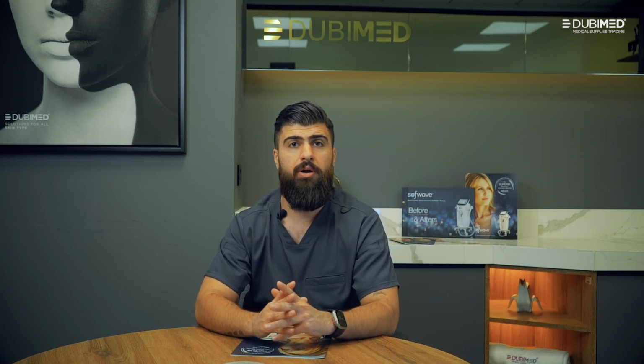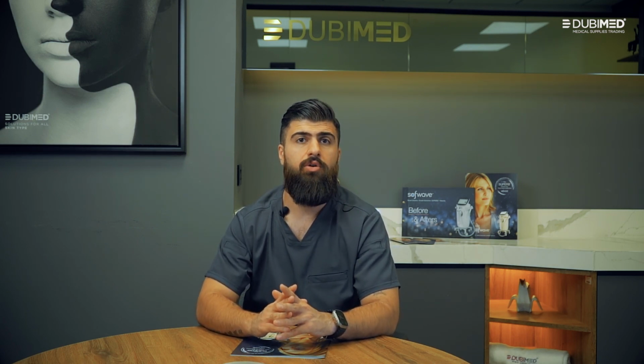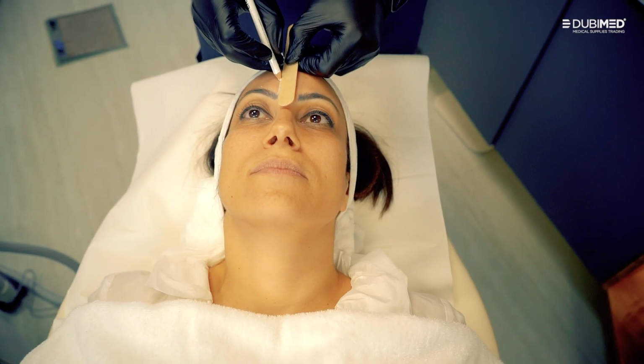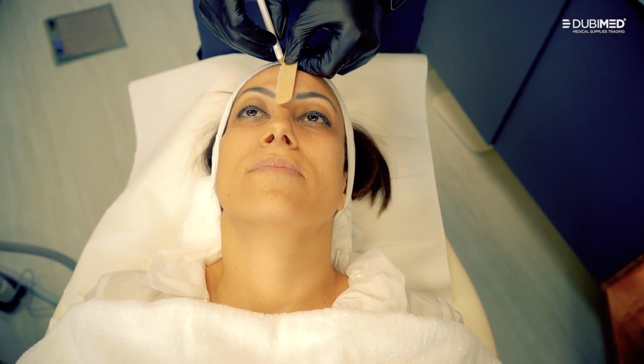Now in this video, I'm going to show you how to turn on the machine, how to set it up, to dial in your parameters, draw the no-fly zones on the face of the patient, and also how to do the treatment step by step. So I will show you the no-fly zones for Sofwave treatment.